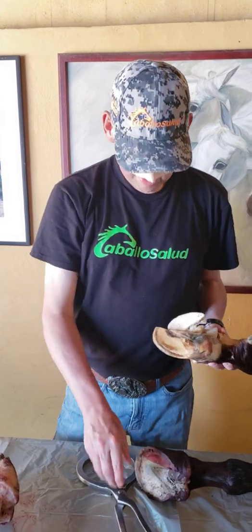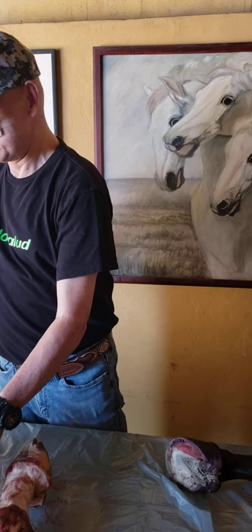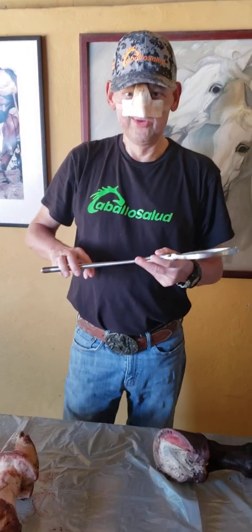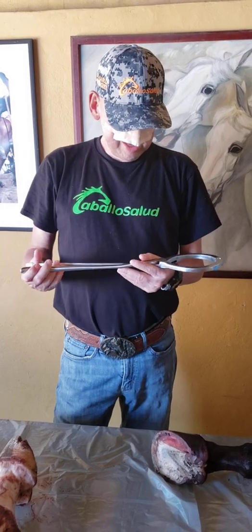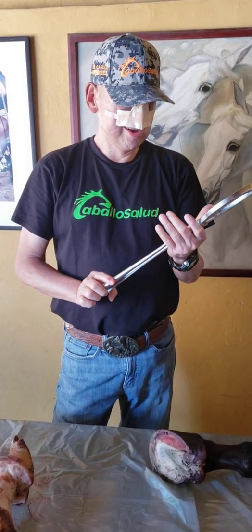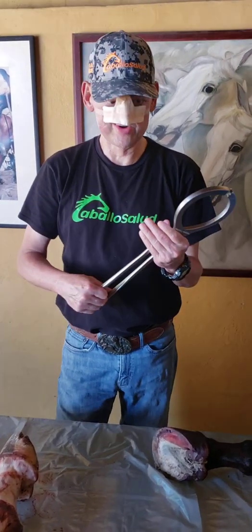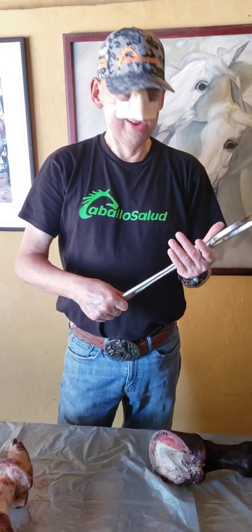I'm also showing you this wonderful diagnostic tool, which is very cheap, and for those that know how to weld and forge, you can make it yourself, or you can buy one. The best size for all kinds of horses is this size. You can use any brand — they are almost all the same, there is no difference between brands. So you can look for the cheapest price and they will do the same work.